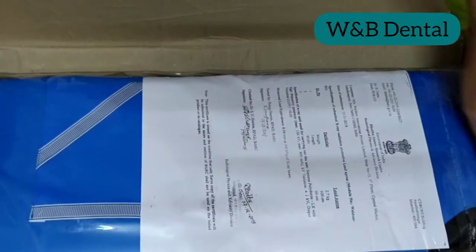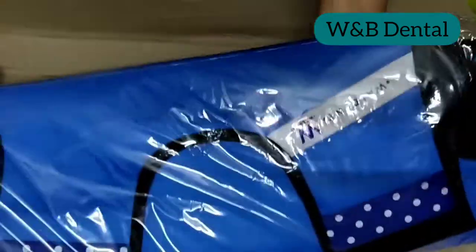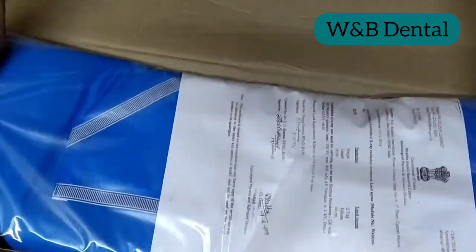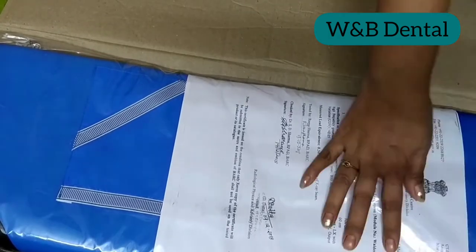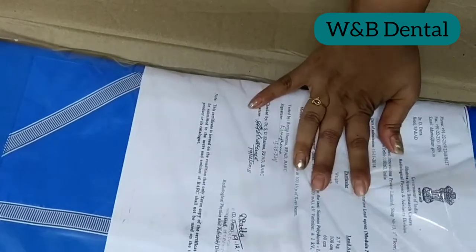Dental X-rays are an indispensable tool in diagnosing and monitoring oral conditions, and it is important to use a dental lead apron during such procedures to protect yourself from X-ray exposure. A lead apron is a type of protective shield constructed of thin rubber with lead inside, shaped like an apron.